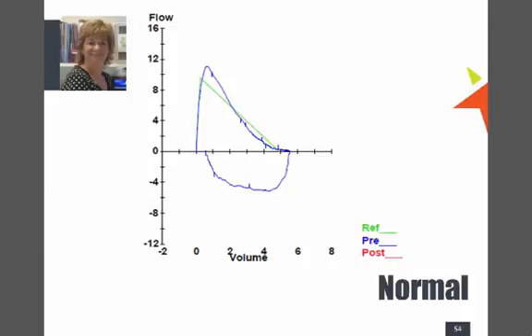All right, so these have been split into two slides. Number one, we're looking at the picture, so we're going for that flow volume. On your printout, there's a green line, a brown line, whatever. This is what is normal for that person. This is what is expected for this person of this age, height, race, and sex. So that person is blowing out really pretty well, and they've got really good volume. We could assume that's pretty good.